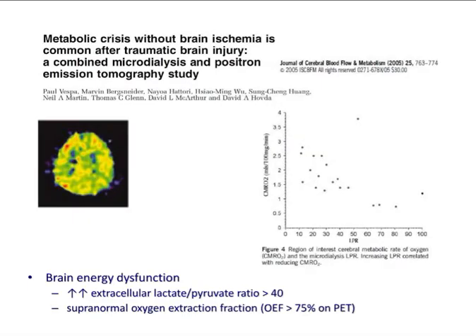And this again has been shown by studying cerebral microdialysis. We have at least increased our understanding about how things are going on in the brain injured patients. And I think that at least this tool has, in my personal view, increased our knowledge of certain processes. And if we have talked today about certain things, there is definitely some knowledge coming out from cerebral microdialysis studies. And again, lactate to pyruvate ratio may be elevated not only because of ischemia. So this is important.